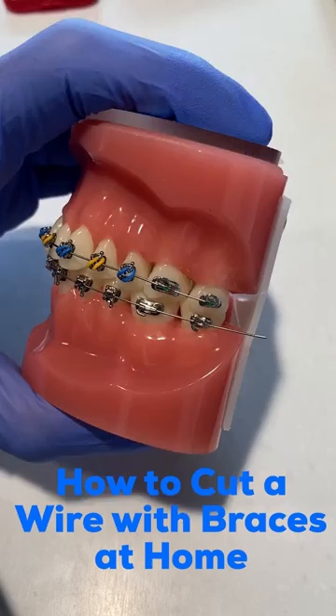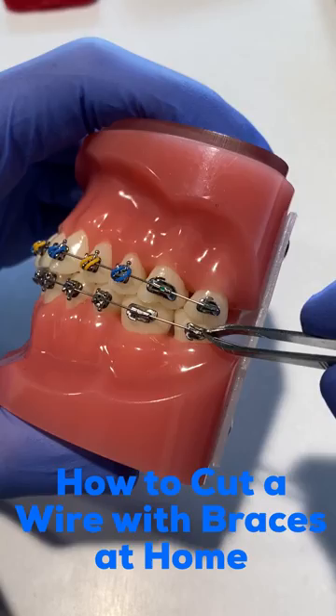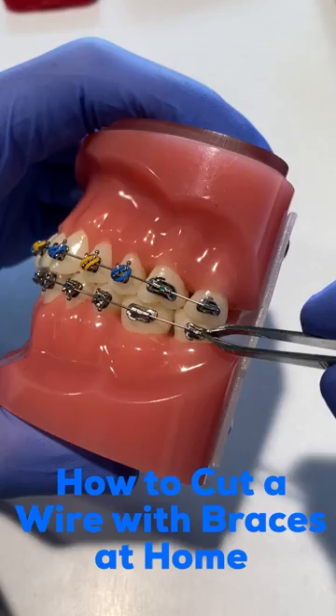Then take this section out either with your hand, or you're going to use a tweezers — again, something that you can find in the house — and take that wire section and throw it away.